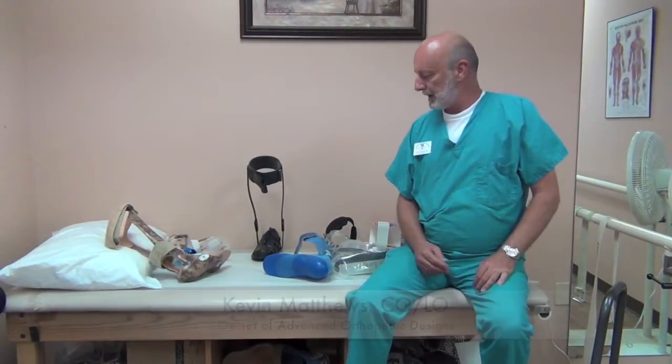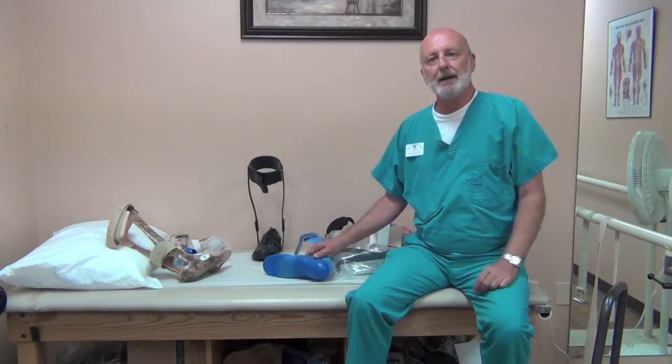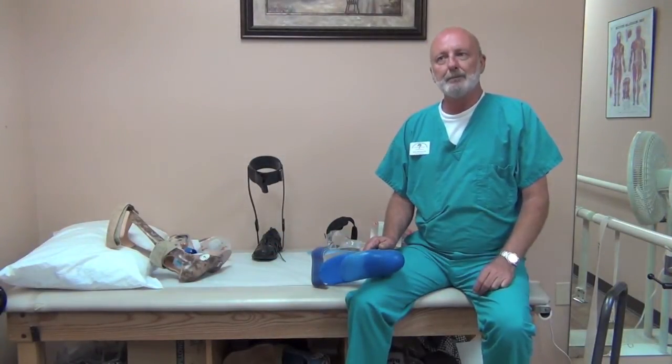Hello, my name is Kevin Matthews and I'd like to discuss briefly with you different AFO designs or brace designs for treating foot drop, also known as peroneal palsy.